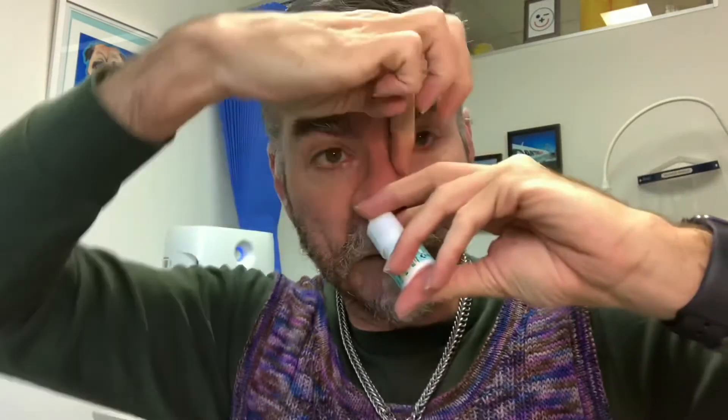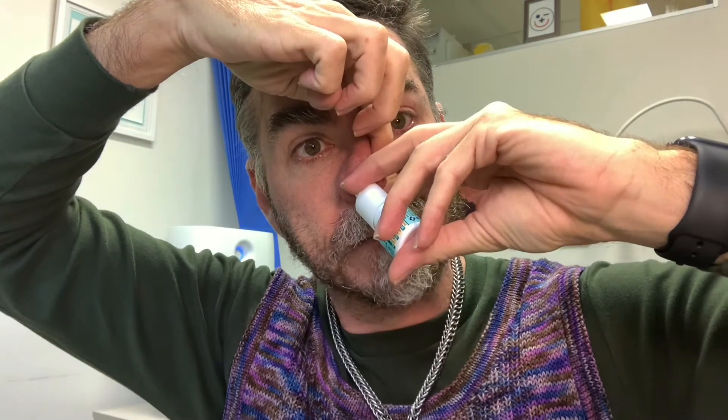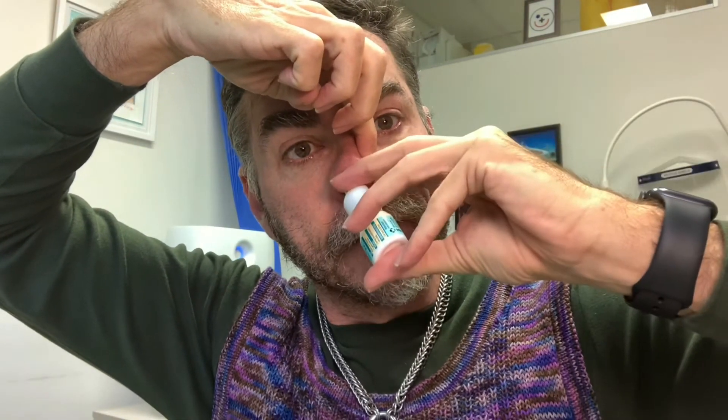On the other side, you switch hands. It points into the nose towards the ear. Block the other side, start breathing in and spray.